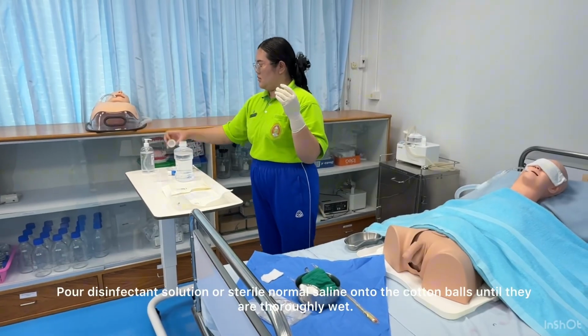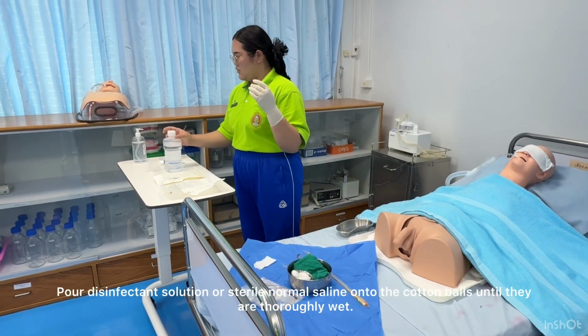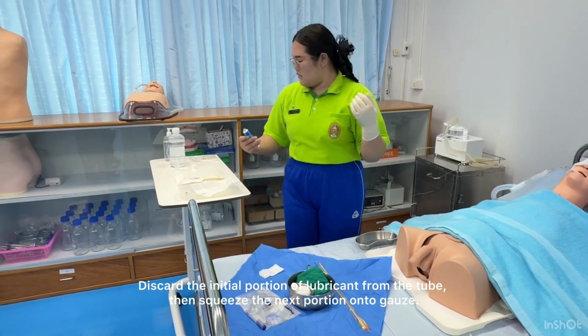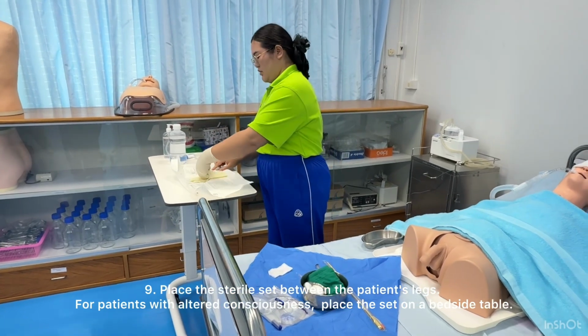Pour disinfectant solution or sterile normal saline onto the cotton balls until they are thoroughly wet. Discard the initial portion of lubricant from the tube, then squeeze the next portion onto gauze. 9. Place the sterile set between the patient's legs.